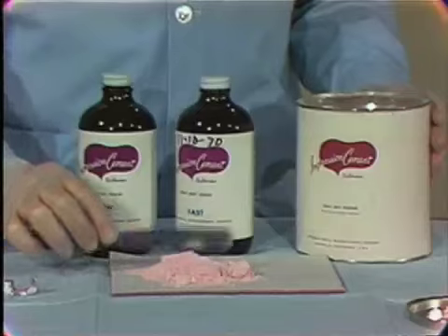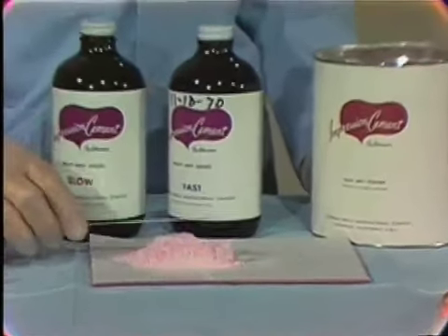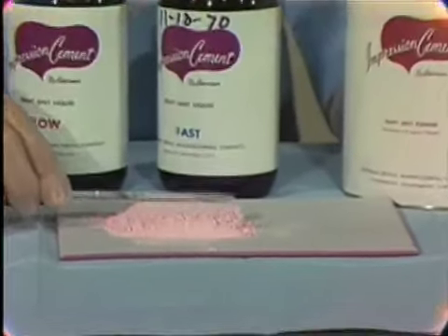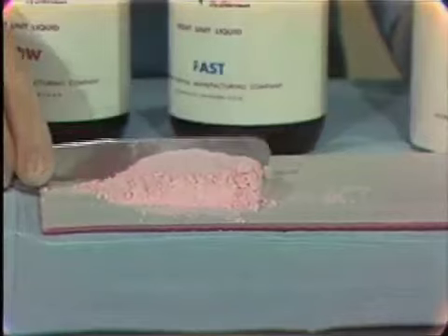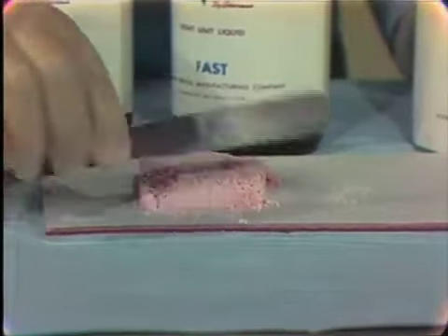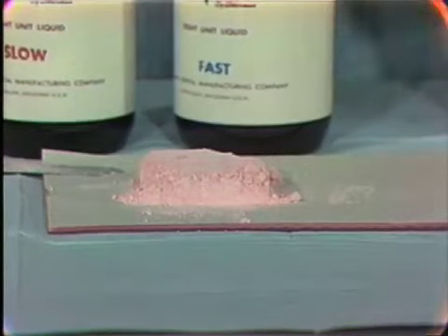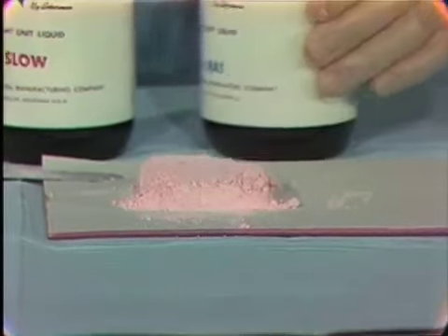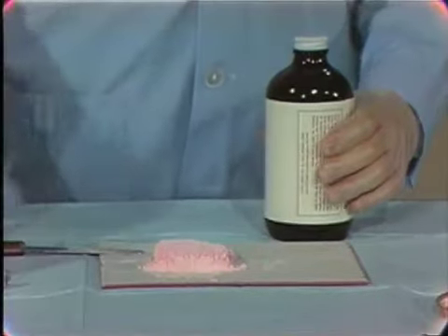Paste the powder on the pad. Square it up till it covers an area that's about a ½ inch thick. Then the amount of liquid that we pour out there would be an area equivalent to the area covered by the powder.